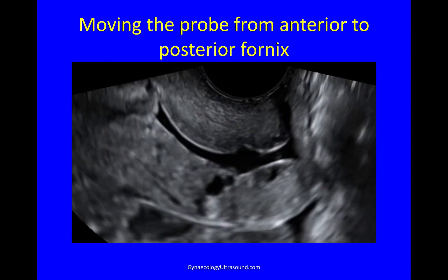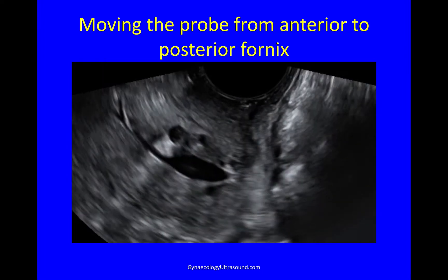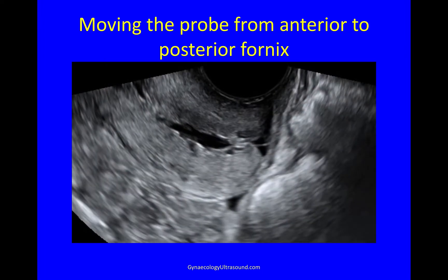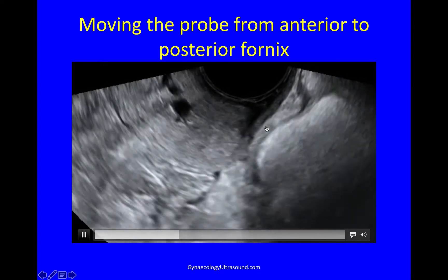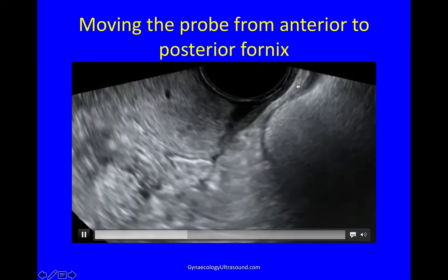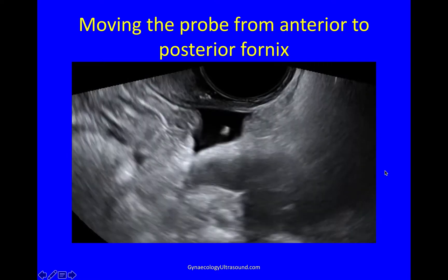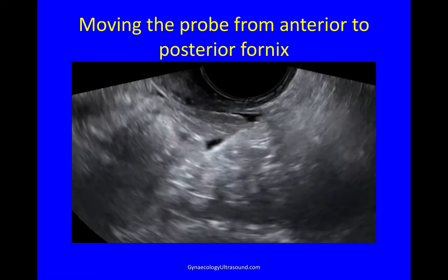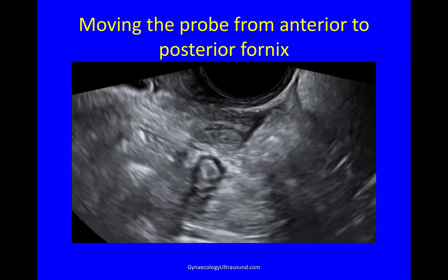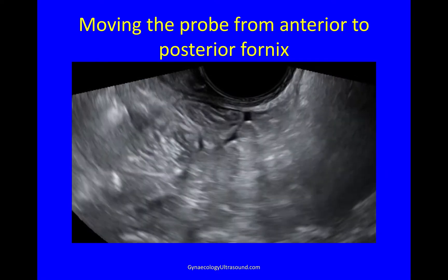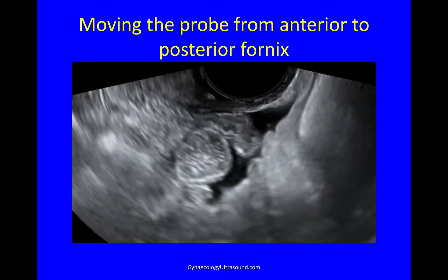There's the normal sliding sign. I'm pulling it out slightly, angling it backwards, and there you can see posterior vaginal wall — the probe is now going into the posterior fornix. That allows me to see the pouch of Douglas and the bowel in a lot more detail; it's much easier this way to see bowel nodules.